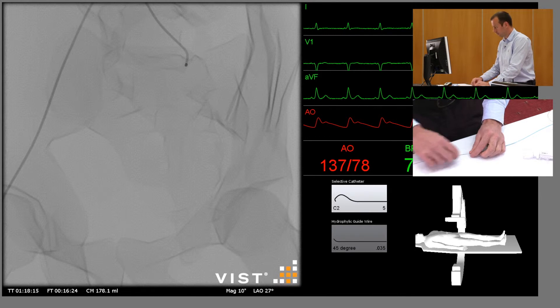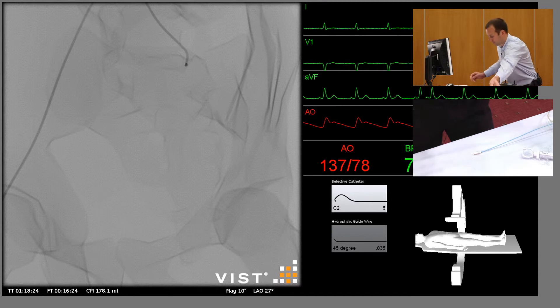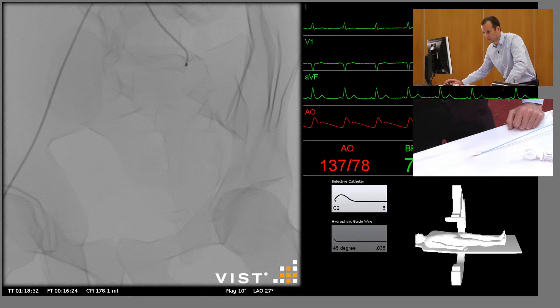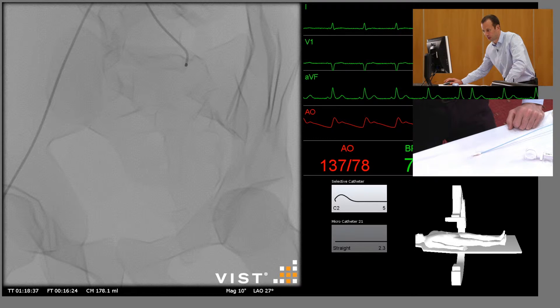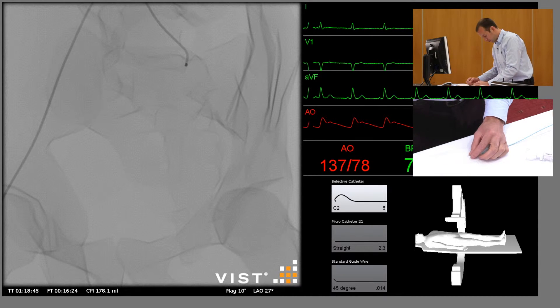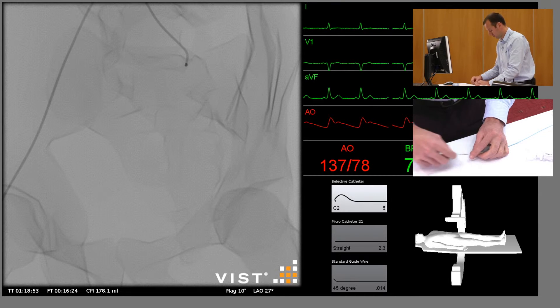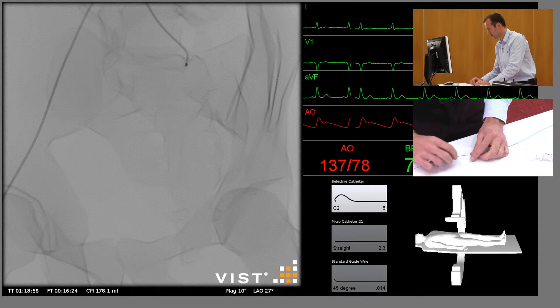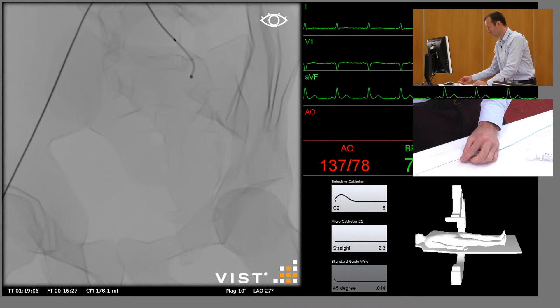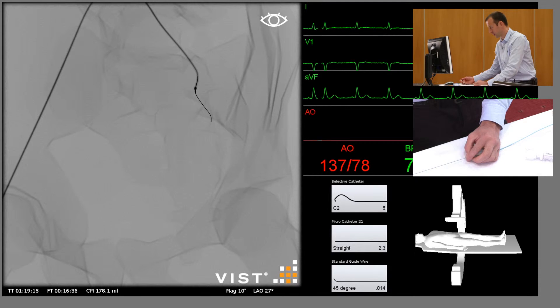We're now going to exchange this guide wire for a micro catheter. So we need to select this from the inventory — we're just going to use a straight micro catheter and then a 014 guide wire with an angled tip — and insert this combination through the catheter. So we're going to see the micro wire and the micro catheter advancing now.